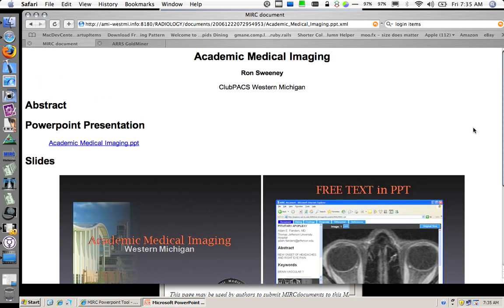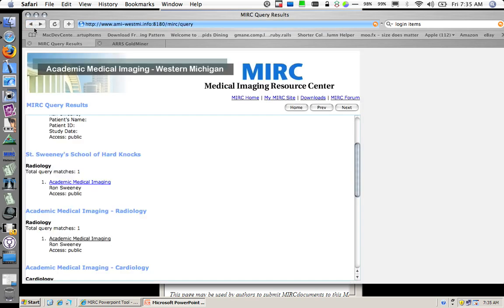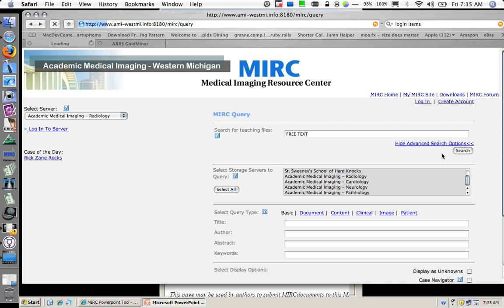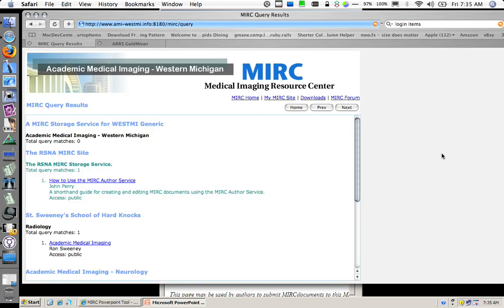Pretty neat. And another thing I wanted to show you in this short screencast was here is this free text. I am going to go back to my query window and search all of them for the free text string.